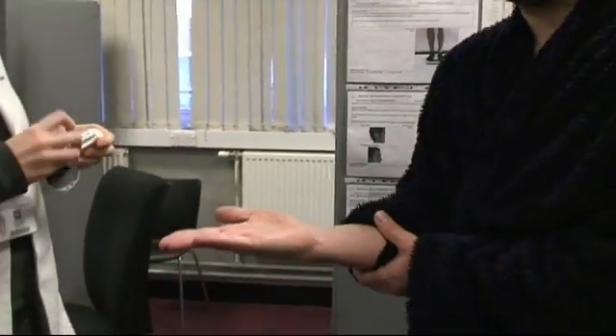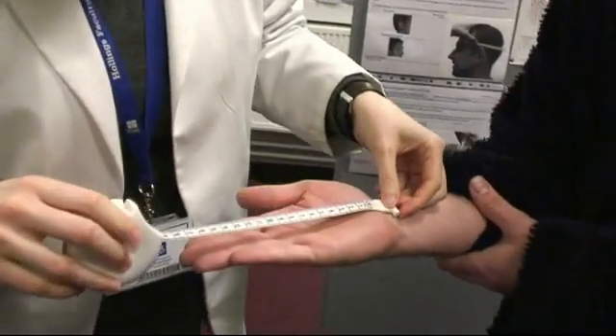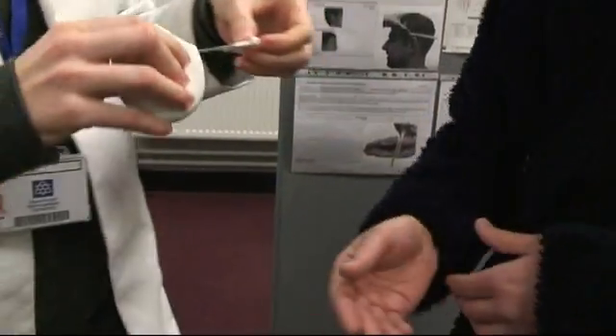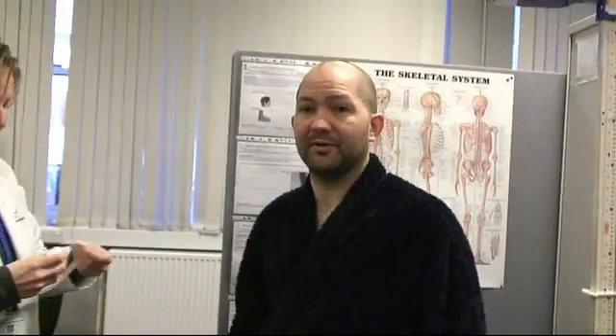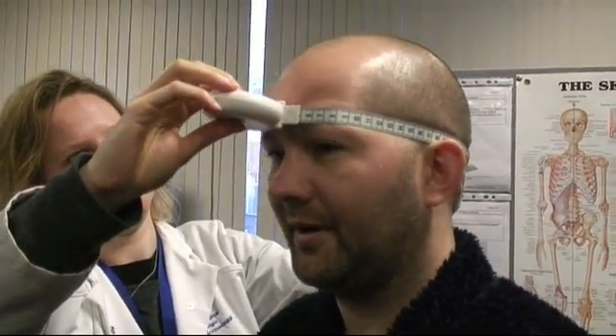Next, we'll record the hand length, which goes from the wrist to the tip of the longest finger. The final measurement from this series is your head circumference — looking straight ahead, this measurement will be taken around the head and above the ears, and will be recorded. That's the end of the manual measurement process, and then we'll begin the scan process itself.